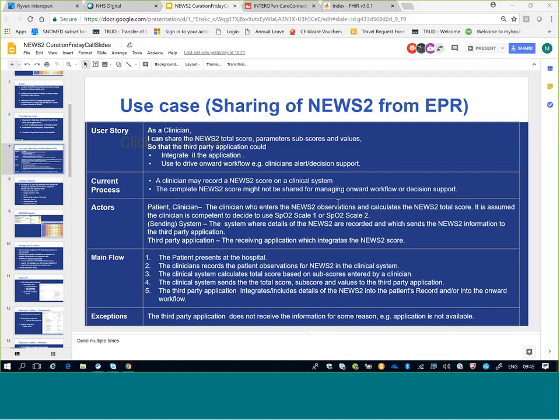Okay, so you're saying the clinicians record the raw observations and then they get the NEWS score after that? No, the clinician wheels the device to the bedside, attaches the blood pressure cuff to the patient, and they don't actually transcribe anything. The machine takes the vital signs directly. Obviously, they would have to do the temperature manually, but the ones that come off the device are automated. The device and the software within it are one integrated unit, and what we get outputted is the observations and the score already calculated. Okay, so you've got device integration with the blood pressure machine.